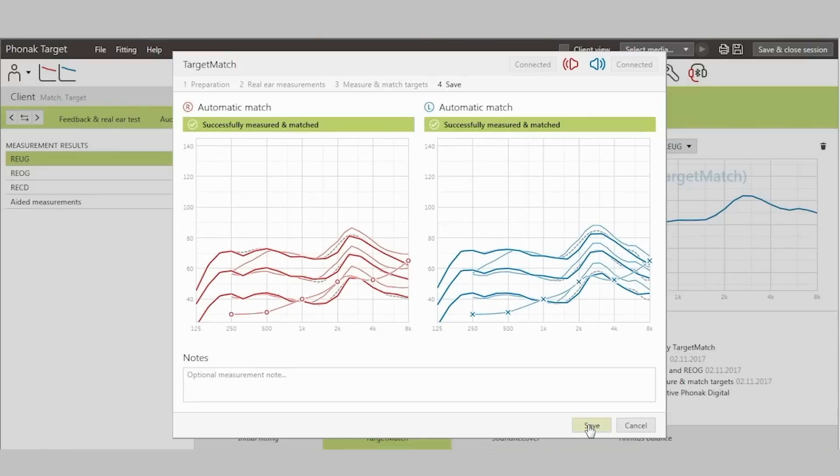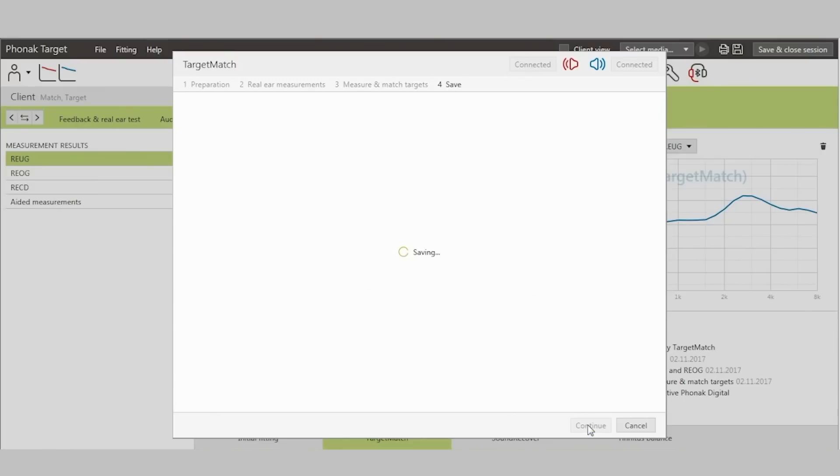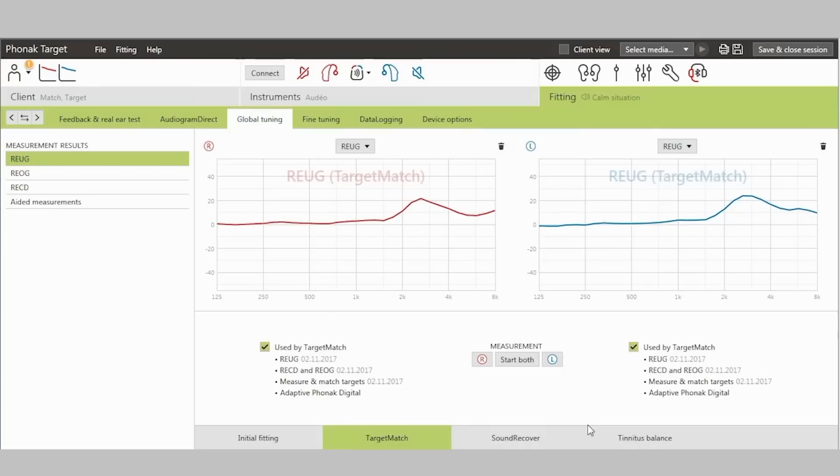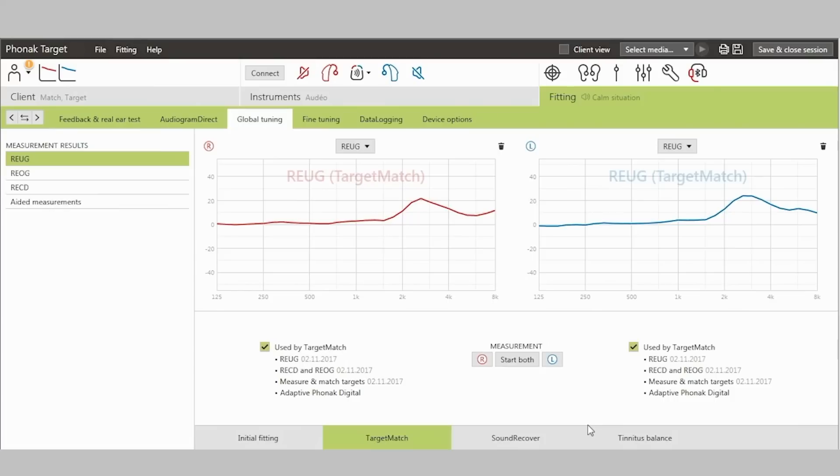When you press Save, these measurements are stored both in Target and in NOAA for easy access. You have now seen and experienced target match. Its unique guided probe tube placement and workflow allows the ability to easily and automatically match any standard prescriptive and proprietary fitting formula.